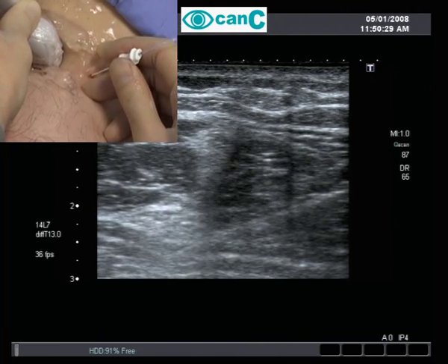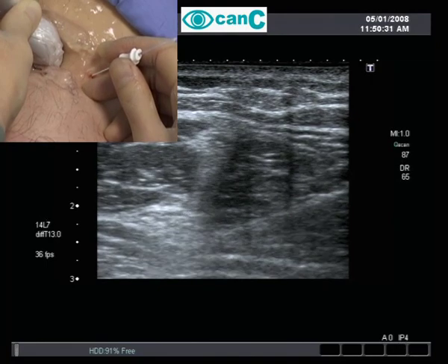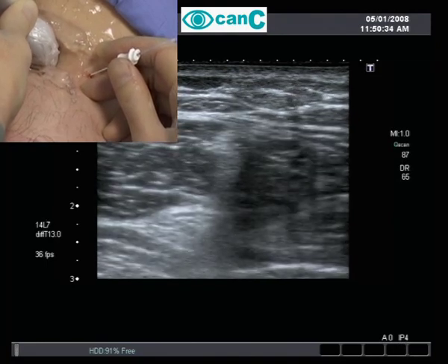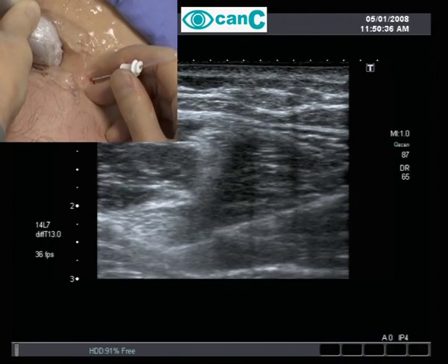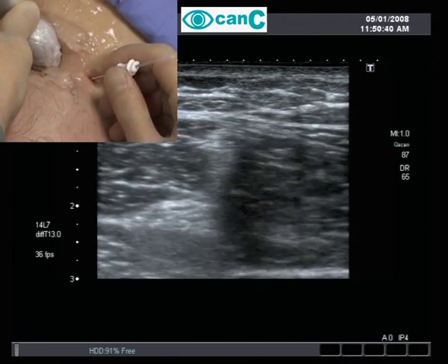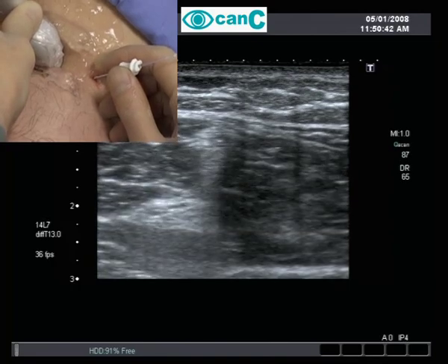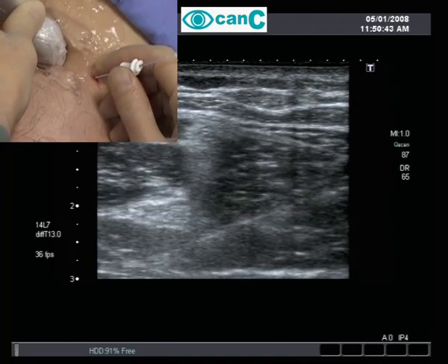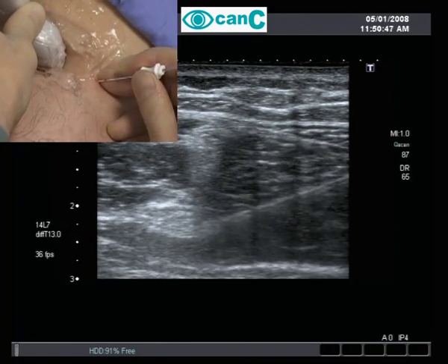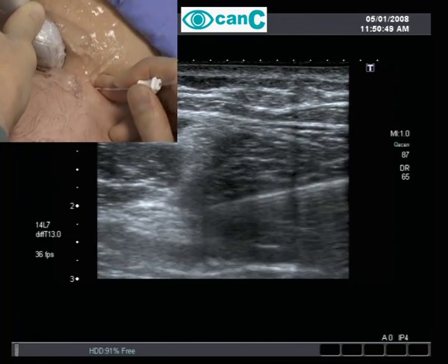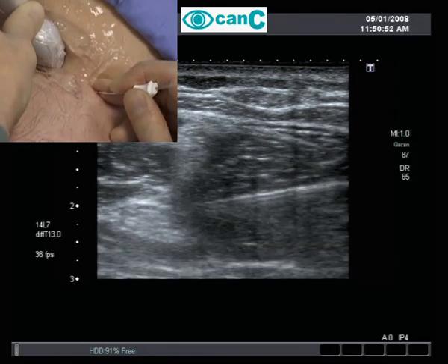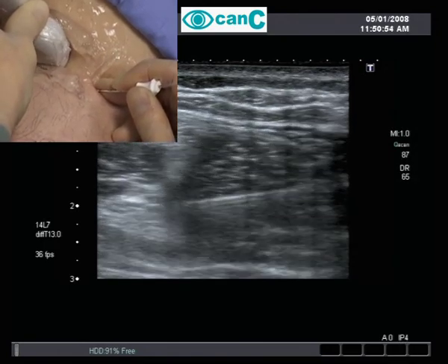A small test injection confirms spread of local anaesthetic underneath the nerve. Advancing the needle further allows injection of further aliquots of local anaesthetic. The needle is now redirected to lie superficial to the sciatic to facilitate a more circumferential spread of local anaesthetic.